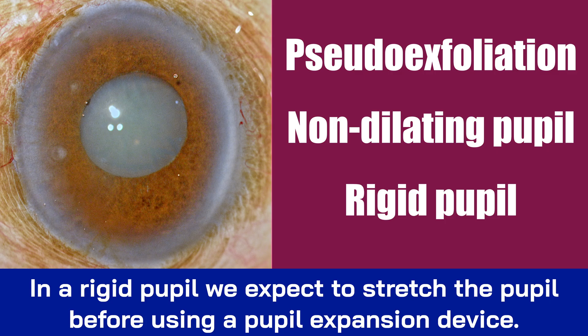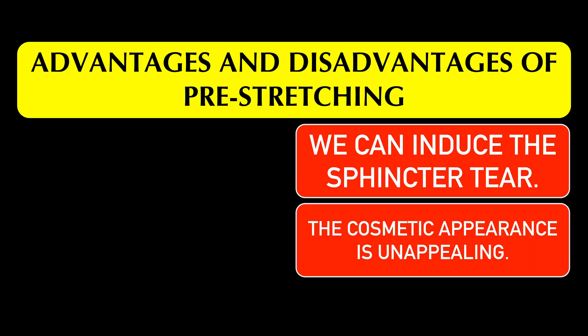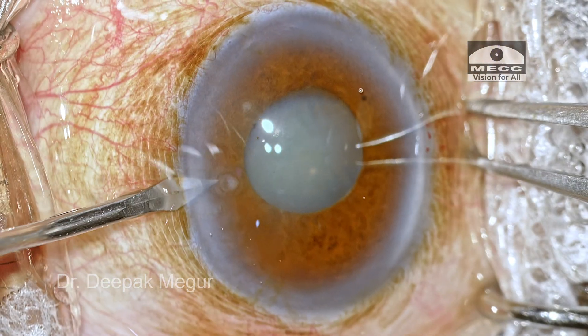Classically we're expected to stretch the pupil before using the expansion device, but of late I'm avoiding pre-stretching because many times I can just squeeze in a ring. The disadvantage of stretching beforehand is that we can induce sphincter tears, which can be cosmetically unsightly post-op. The advantage of pre-stretching in a rigid pupil is that it makes B-Hicks device engagement much easier. Let us see what happens if we don't pre-stretch in this case.